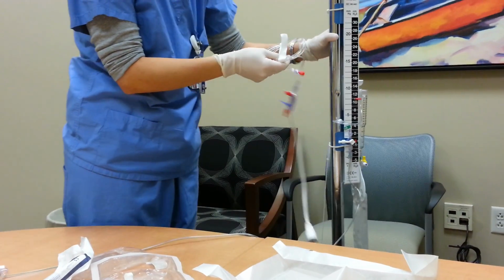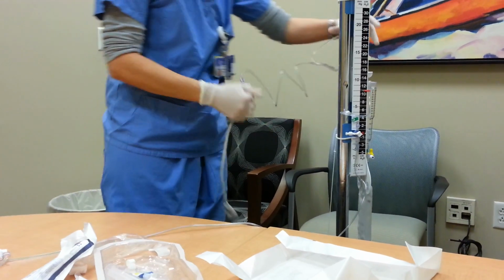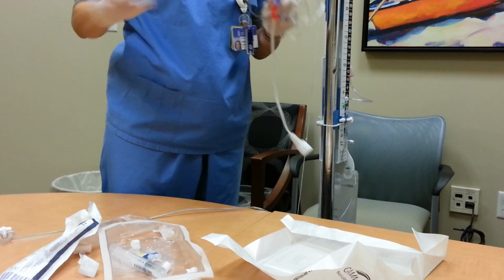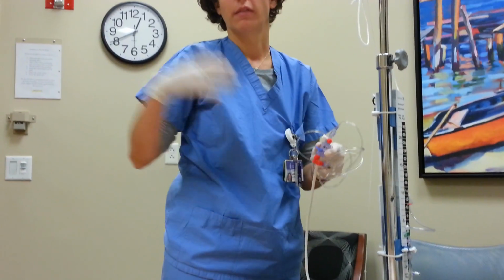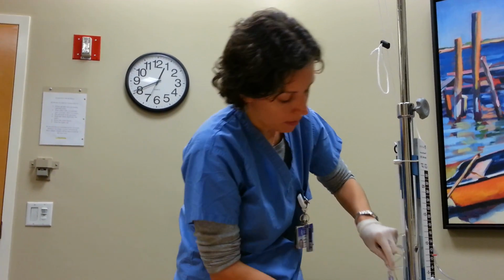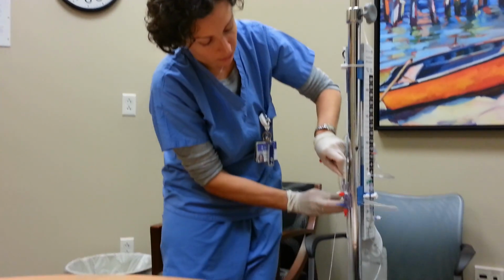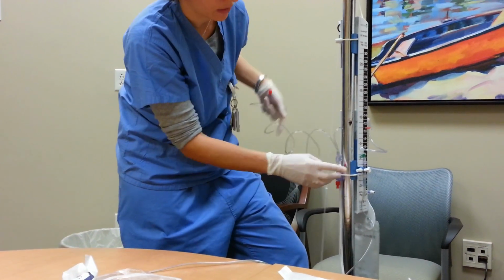So this particular device does not come with an actual place to attach the transducer, so we've sort of jerry-rigged it. Just like when you're transducing an A-line, you need the transducer at the level of the phlebostatic axis. In this case, you need it at the level of the tragus, just like we leveled it for drainage. So this being the 0 mark, what we do is we just take the rubber band and use it to attach the transducer, like this. So it's automatically at the 0 mark.